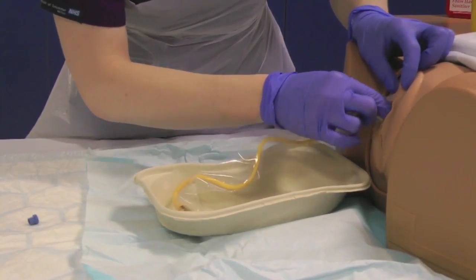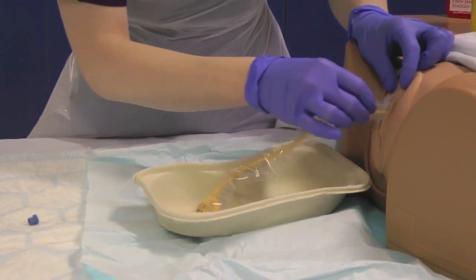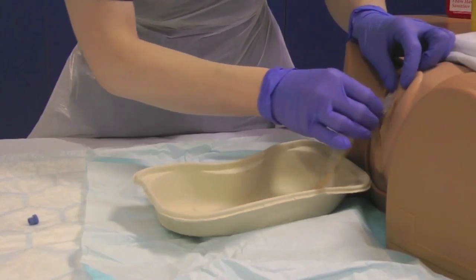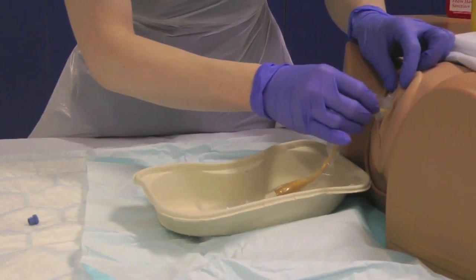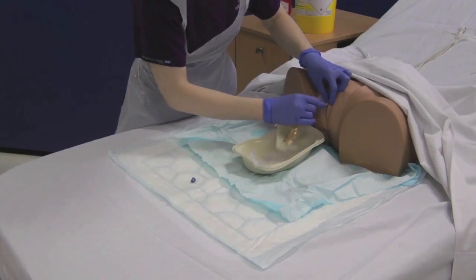Avoid touching the catheter directly, using the packaging as a barrier. You may need to part the labia at this point. Insert the catheter along the urethra into the bladder. If there is any resistance, ask the patient to cough, which may ease insertion. Never force the catheter. Once the urine starts to flow, advance the catheter a further 5cm.